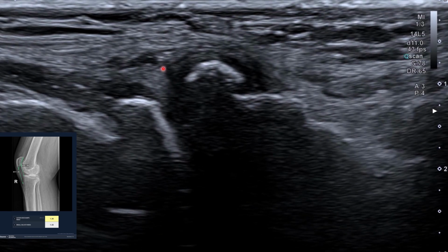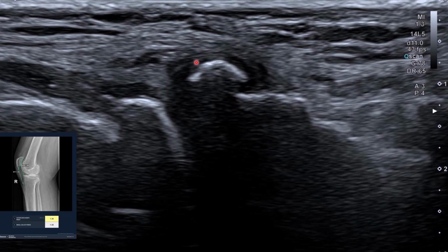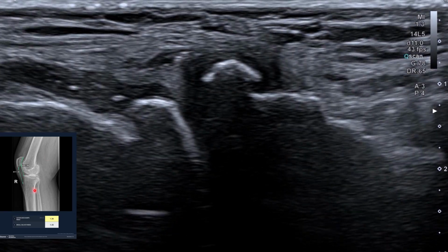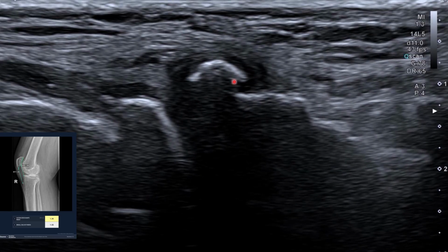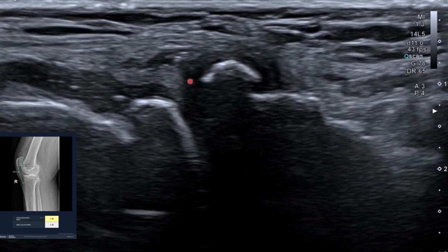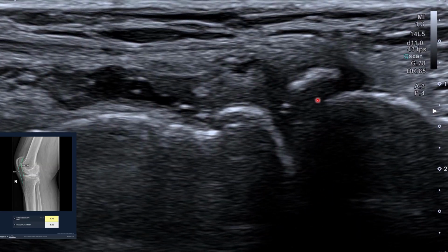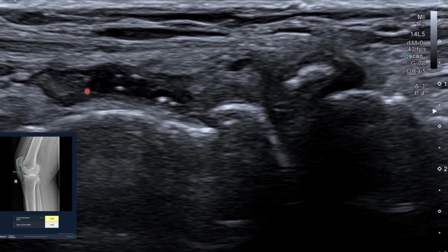So osteoarthritis is one of those things, especially in adult age, that can pose a challenge. Some of these things are small bone fragments like this. They can be difficult to visualize nicely on X-ray. So these sub-centimeter loose bones can be difficult to resolve on an X-ray. They will need a sonar like that. If your machine has a high resolution, you can nicely see what is going on there, and the patient is having a lot of pain. So you can have a good view of that.